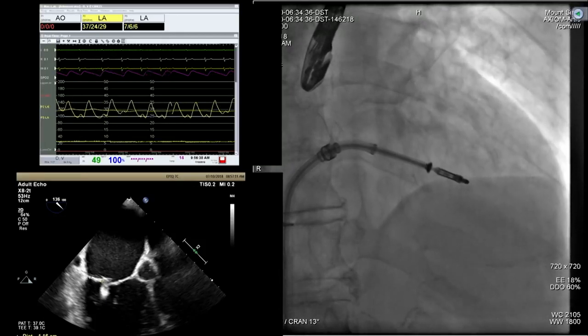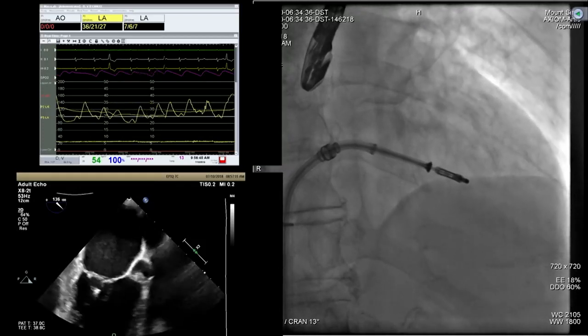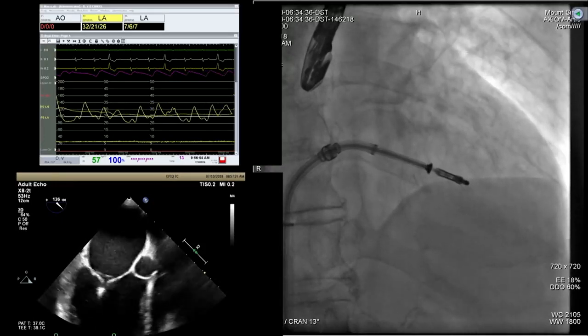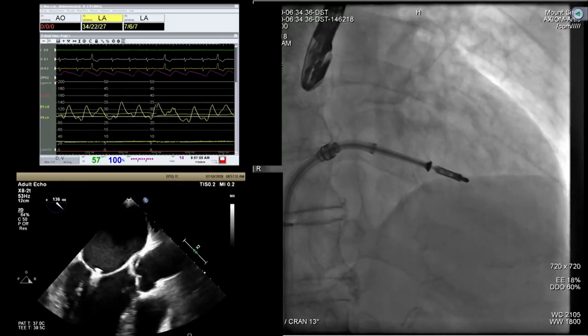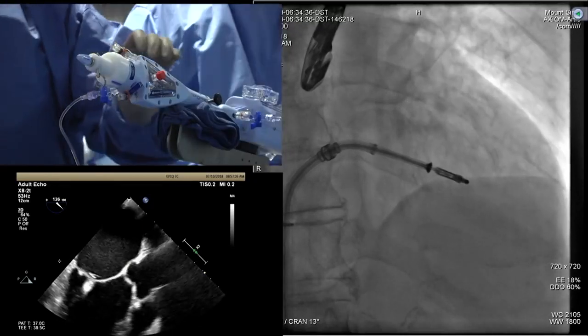You know? So, Gila, you want to comment on the length? Yeah, it's 1.2. I think we started at 1.6, right? So it looks like at least more than 7 millimeter of insertion based on the leaflet. The pre was 1.8 centimeters. So that's good. So I think we are going to the step of release.